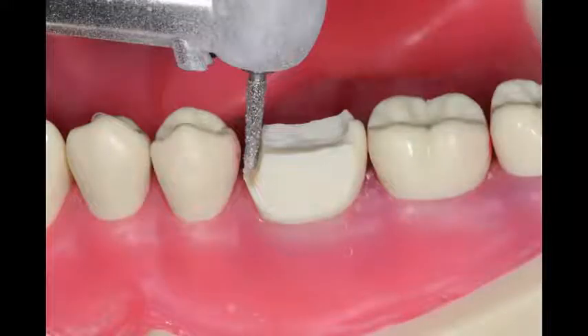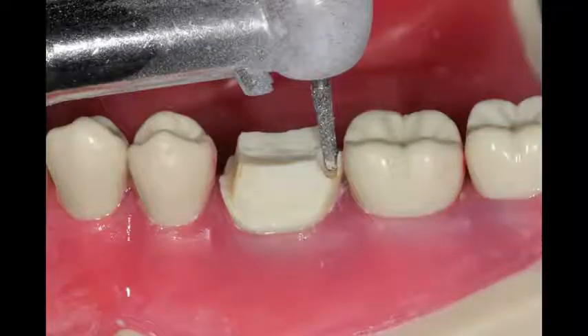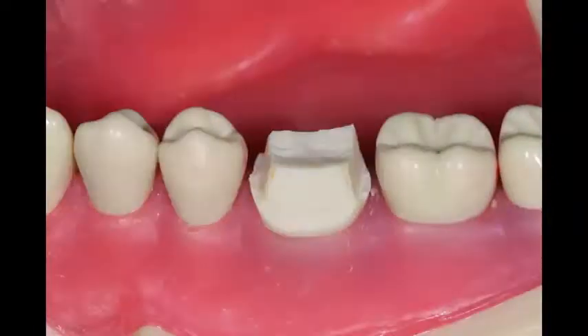As I'm going across buccal, lingual, going down the interproximal, I'm going to try to leave a small sliver piece of enamel between the burr and the adjacent tooth. That'll help ensure that we don't scuff the adjacent tooth, or if we do, it'll be very minimal.